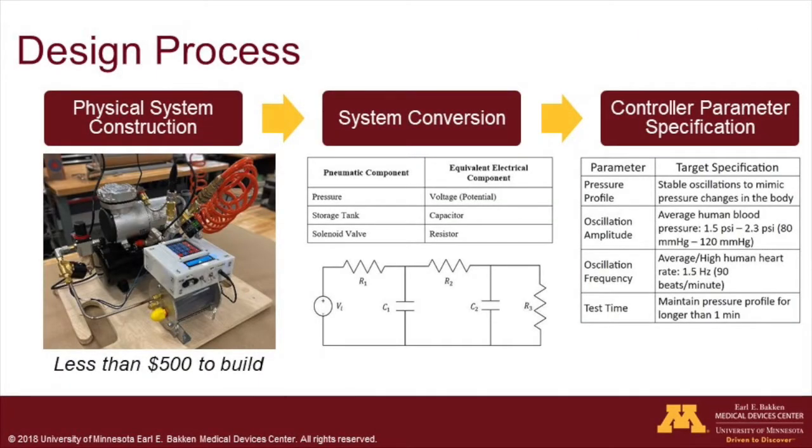In order to address this need for a low-cost catheter testing system, a pneumatic chamber was built with a custom program used to alternate pressure in a similar manner to the human body. Before designing the controller, several important steps were taken to ensure proper design principles.